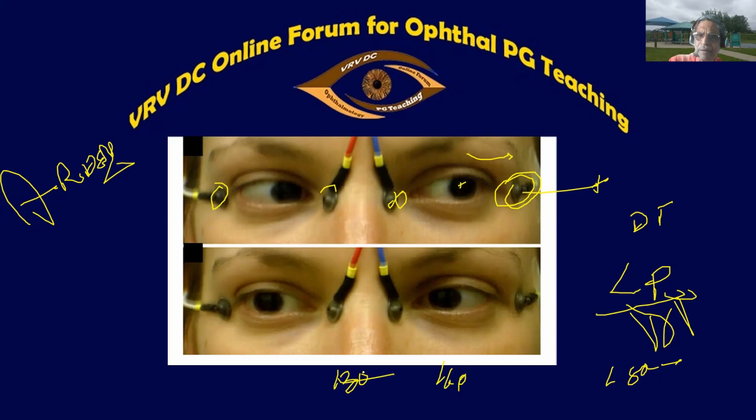Never forget this exam question. The most important investigation to rule out Best disease, Best vitelliform dystrophy of the macula, is your EOG. The Arden ratio will be reduced. It may come to 130, 120, 110. If it is 110, it is pathognomonic. In Best vitelliform dystrophy, the Arden ratio is reduced. This is what you are supposed to tell in the exams.